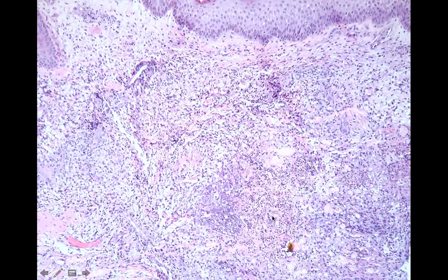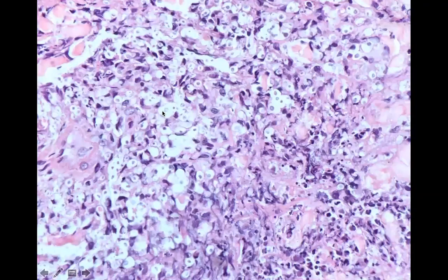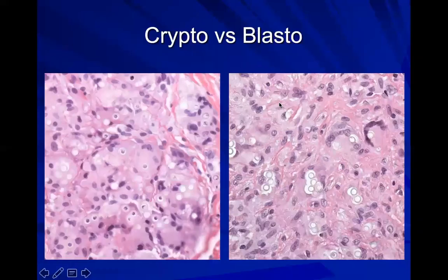You can see your neutrophils, right? Your multi-lobed little dotty cells. And you can see these purplish histiocytes in the background, but then there's all these little white circles. When you go in closely, this is the little halo around the nucleus, right? This is the nucleus and this is a halo. And that's what crypto looks like. Sometimes you can see the blue wall, but sometimes you just see this lack of the wall.